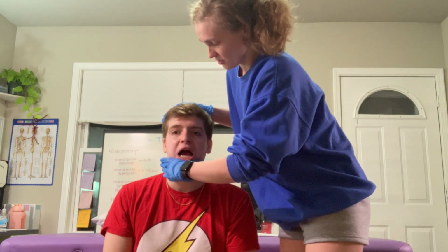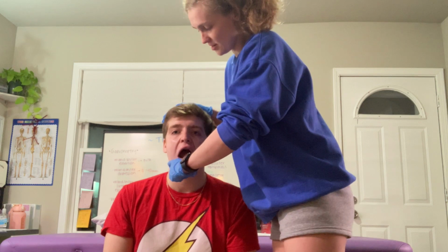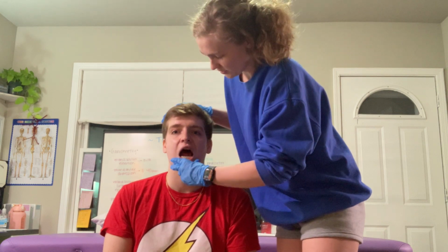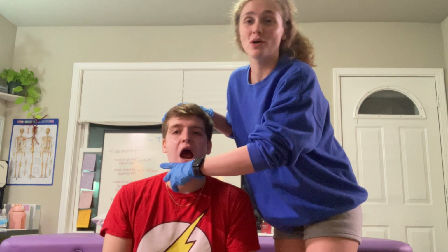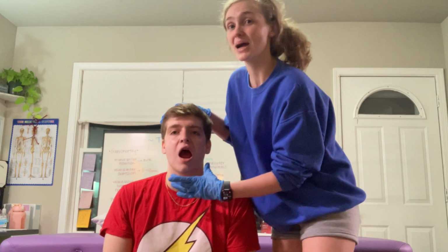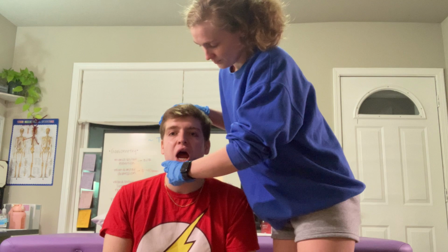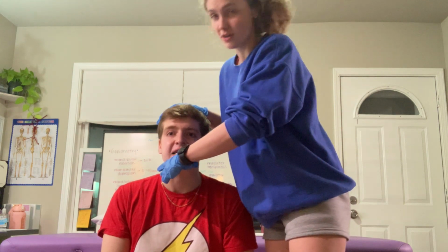Now close a little bit. Nope, open a little bit. And now whenever you're ready, you're going to go against my resistance. 3, 2, 1. Oh, let's go one more time, considering he lost the position, and I don't know if that is from simply losing the position or because his masseter and temporalis muscles are not working properly. Up a little bit. And hold, hold, hold. Alrighty.